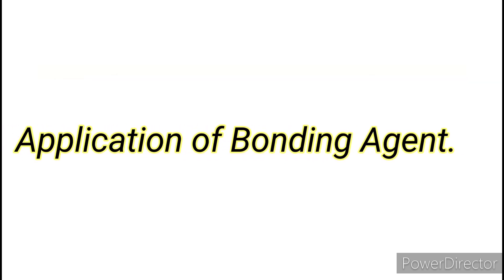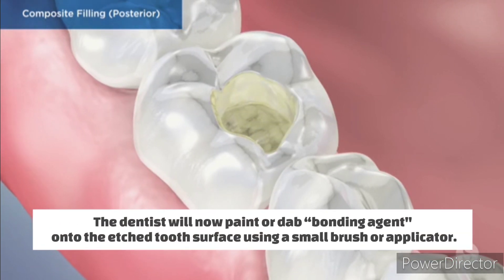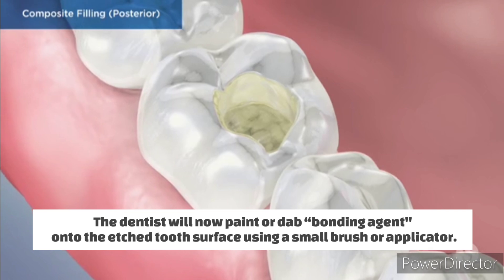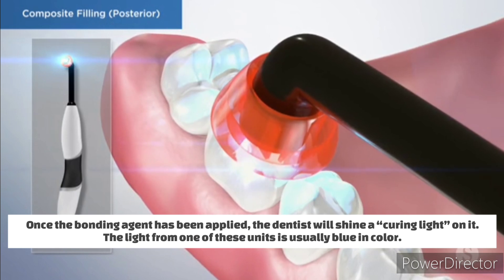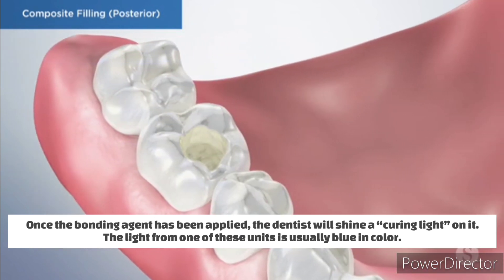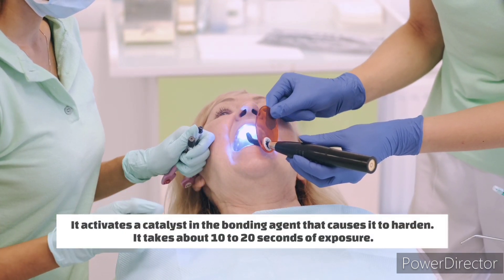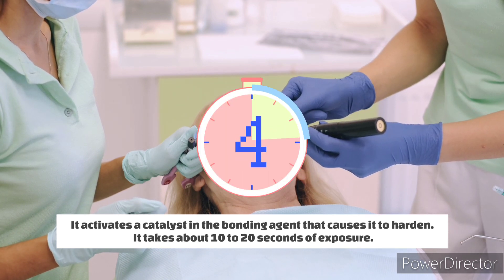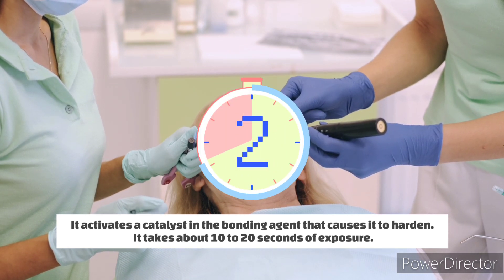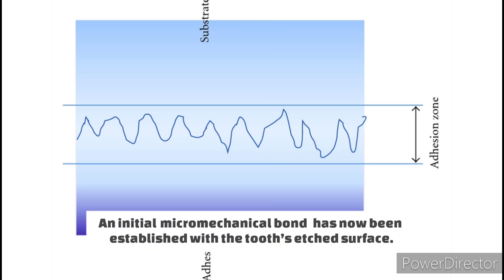Application of bonding agent: the dentist paints or dabs bonding agent onto the etched tooth surface using a small brush or applicator. Curing the bonding agent: once applied, the dentist shines a curing light on it. The light is usually blue in color and activates a catalyst in the bonding agent that causes it to harden, taking about 10 to 20 seconds of exposure. An initial micromechanical bond has now been established with the tooth's etched surface.